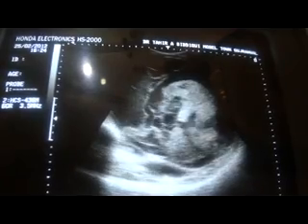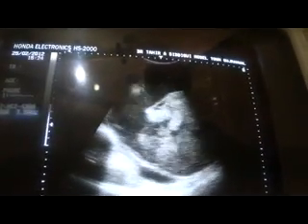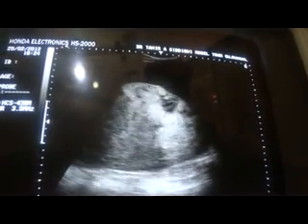This is the area of study. This echogenic area has internal echogenic ball-shaped areas with no shadowing at all.